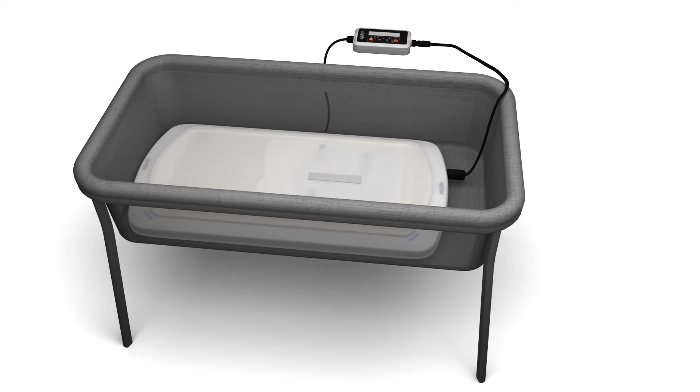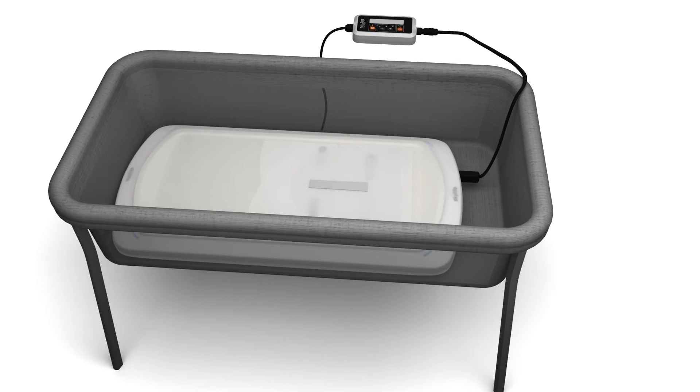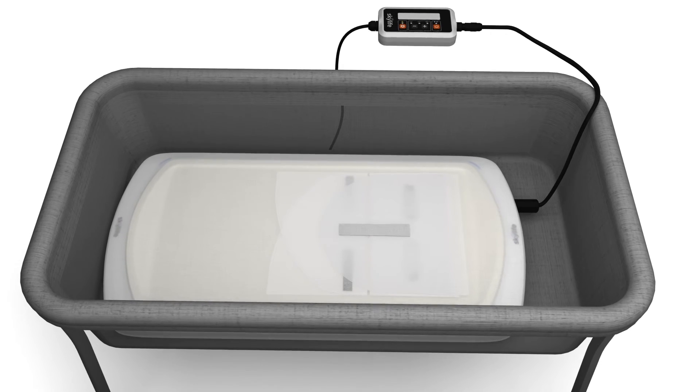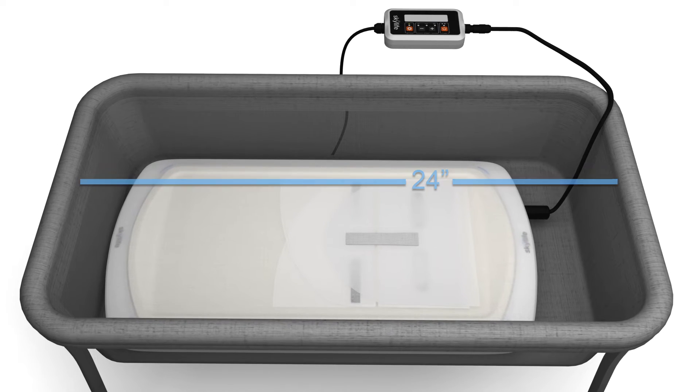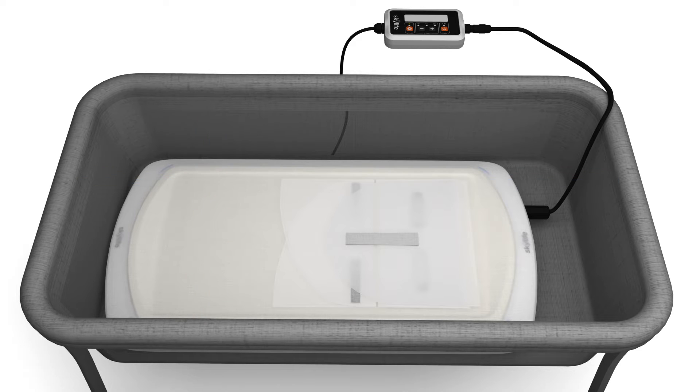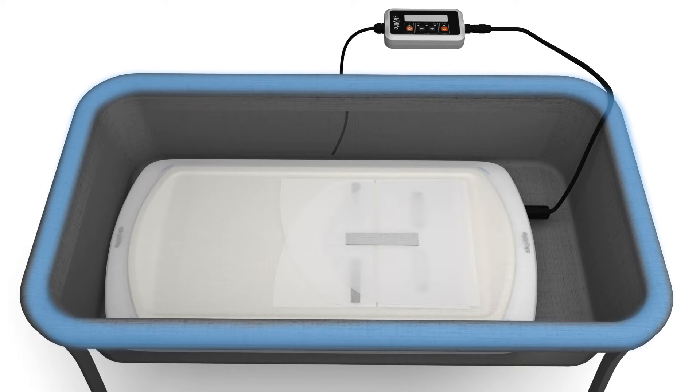Place the controller outside of the crib, bassinet, or incubator. The SkyLife device may be used in any sleeping area that is at least 24 inches long and 13 inches wide. Make sure the cord does not pose a hazard to the baby. The sleeping area should also contain protective walls on all four sides.